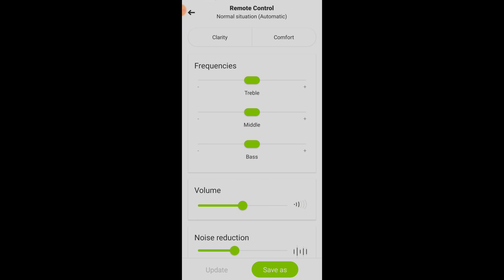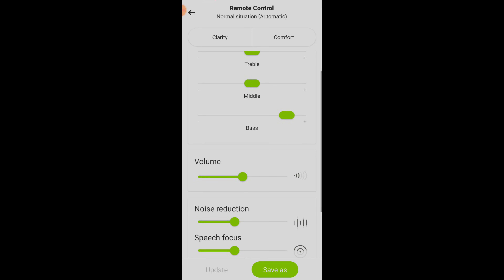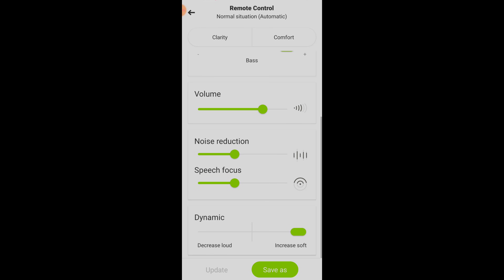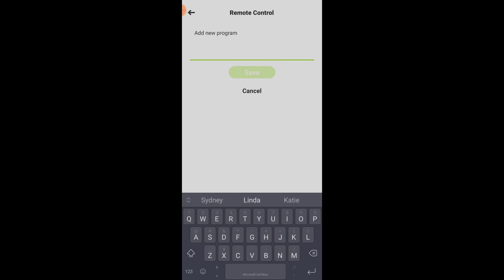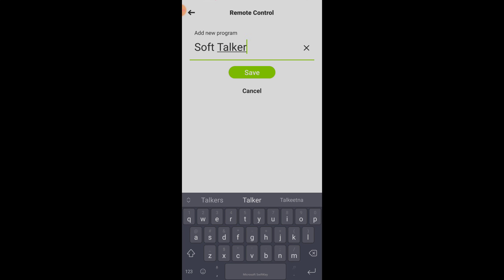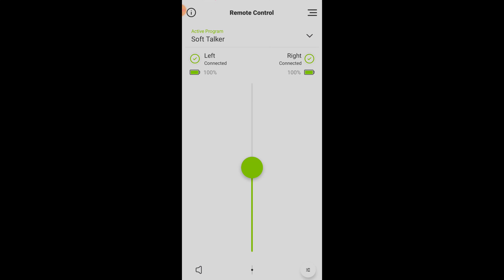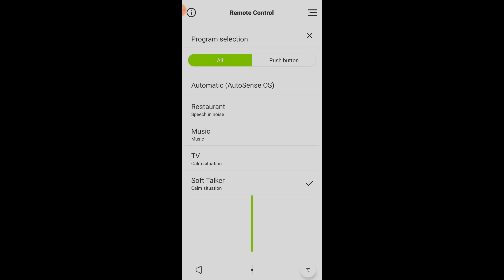After you find the right combination of settings using this approach, I would recommend that you save these settings as a custom program so you can access them again in the future. I want to stress this — you have to save these settings after you are done making them, otherwise your hearing aids will not maintain them. So those are the customizations you would likely want to make if you wanted to hear a soft talker better.